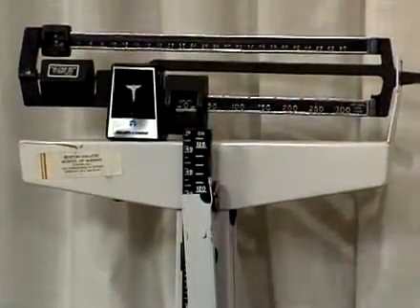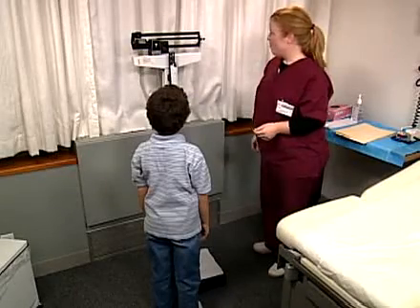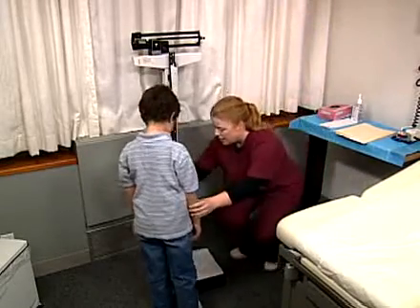Make sure both weights are at zero and the indicator is floating an equal distance between the up and down position. If not, adjust the scale accordingly.